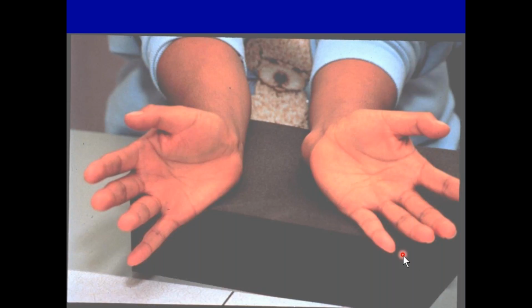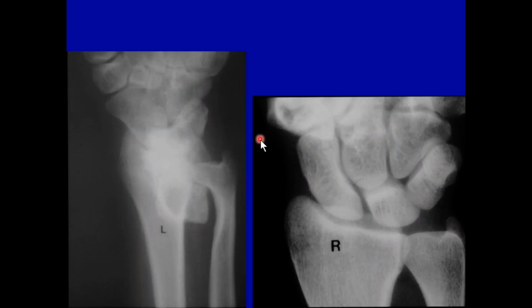Now this is you. It's you and the patient. You can touch this bump and you can say, is it painful? All right, but this is not a digit, this is a wrist. So the most prudent examination here would be a wrist examination, and you know how to do that relative to where the central ray goes. So this is a normal wrist. This is the patient's wrist, and there's something here that shouldn't be compared to a normal one.